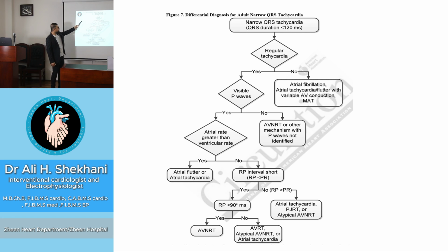First step, whether the patient has regular or not. If it is irregular, the differential diagnosis could be AFib or atrial tachycardia with flutter with variable AV conduction, or could be multifocal atrial tachycardia.